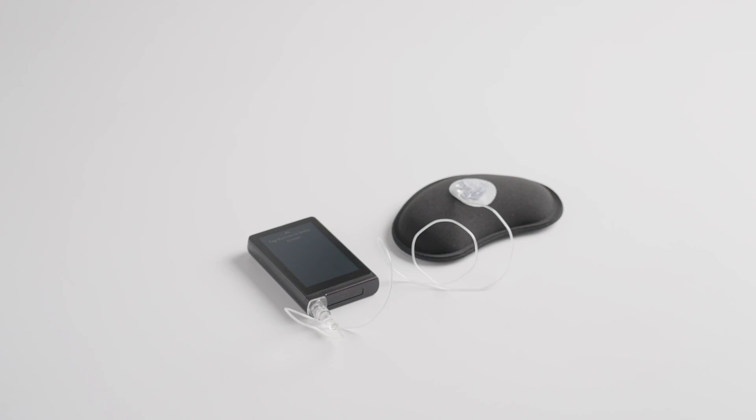Never disconnect from your islet by removing the cartridge from the islet and staying attached to the tubing, or removing the tubing from the islet and staying attached to the tubing. Always disconnect from the infusion set base on your body.